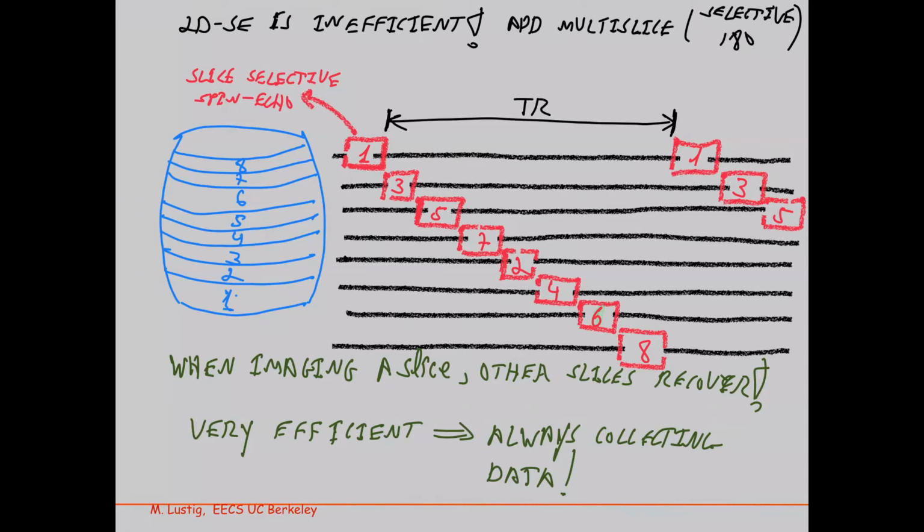Now, one thing that we didn't talk about, and I'm just going to throw it out right now, is there's a lot of 180s going on, right? So a lot of SAR could be, because think about it, in TR, you put some 90, 180, and then you wait for a few seconds, that's not a problem. But suddenly you're squeezing another 180 here, another 180, another 180, another 90, 90, 180, so now SAR increases. Okay, so that could also be a limitation that would limit the number of slices that you can do.